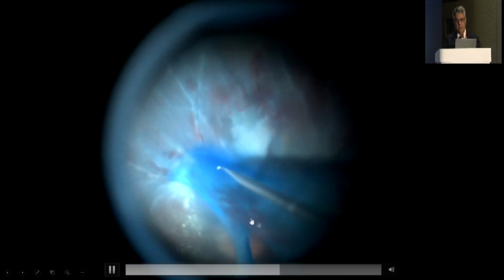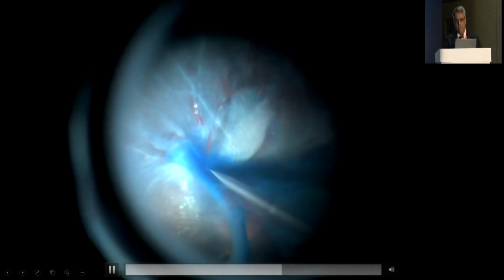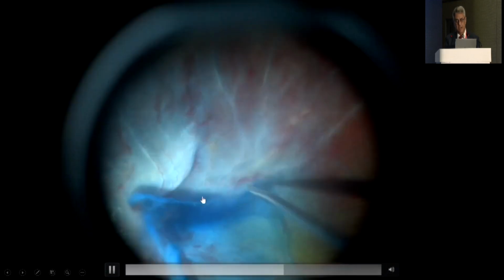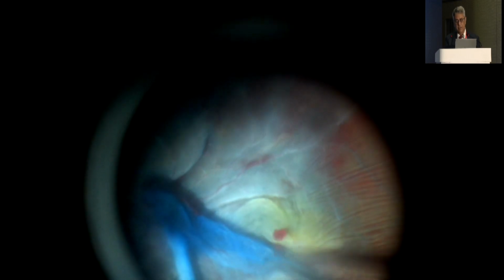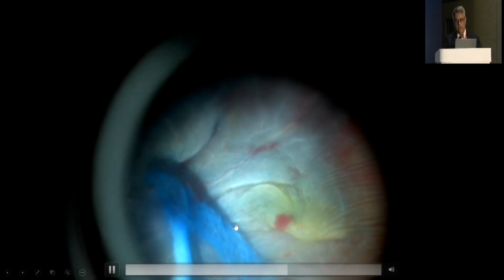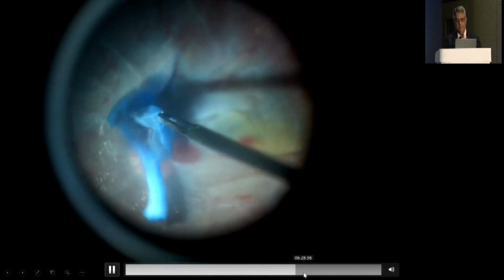This was again an epiretinal membrane in a relatively young patient who had a combined detachment secondary to vasculitis. You see all these vessels virtually closed; it ultimately proved to be Behçet's disease. And again, this epiretinal membrane, but I follow similar steps. Stain it under air and remove this epiretinal membrane, and then carried on the routine surgery for the detachment.